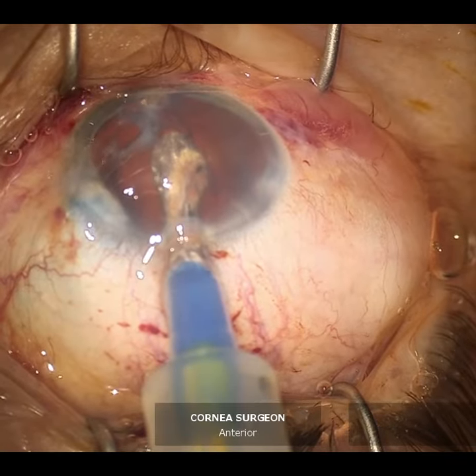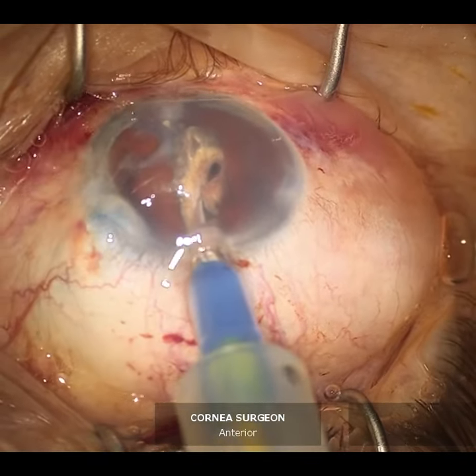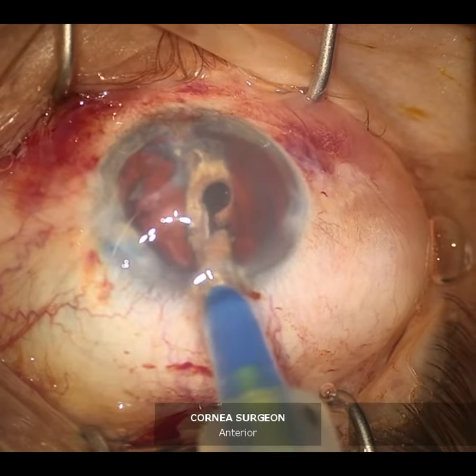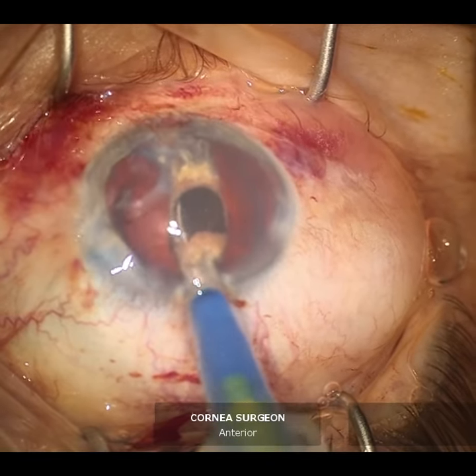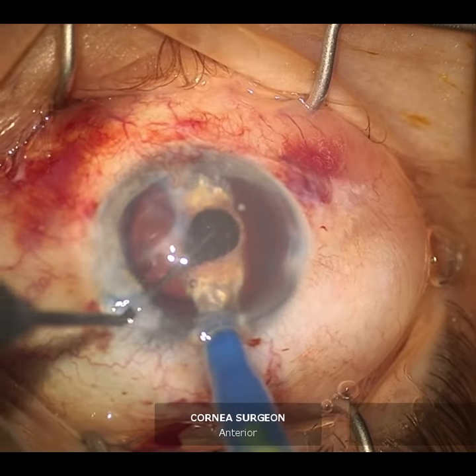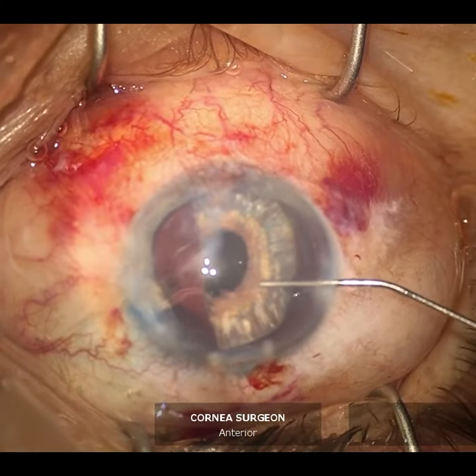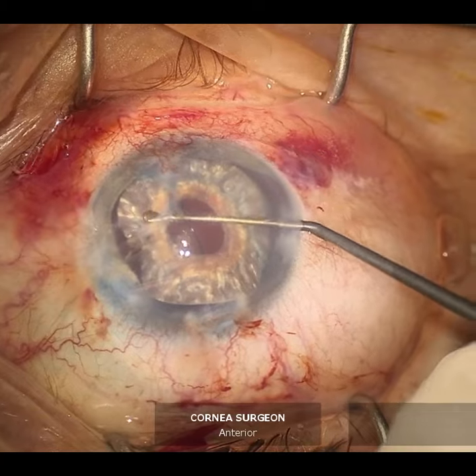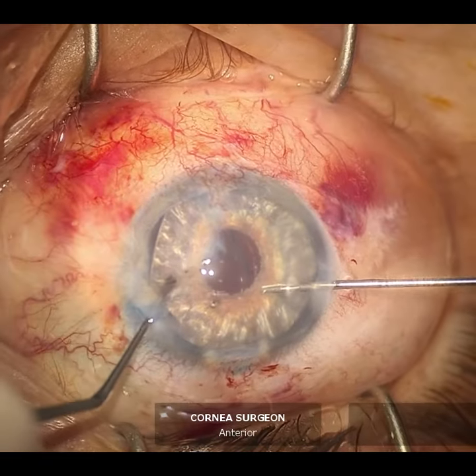The artificial iris was then injected into the capsular bag and unfolded with intraocular forceps and a second instrument. Antibiotics were given and the main wound was sutured.